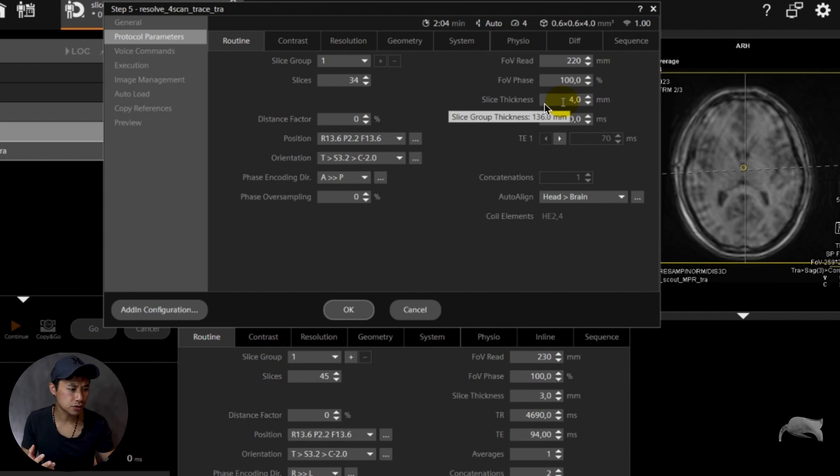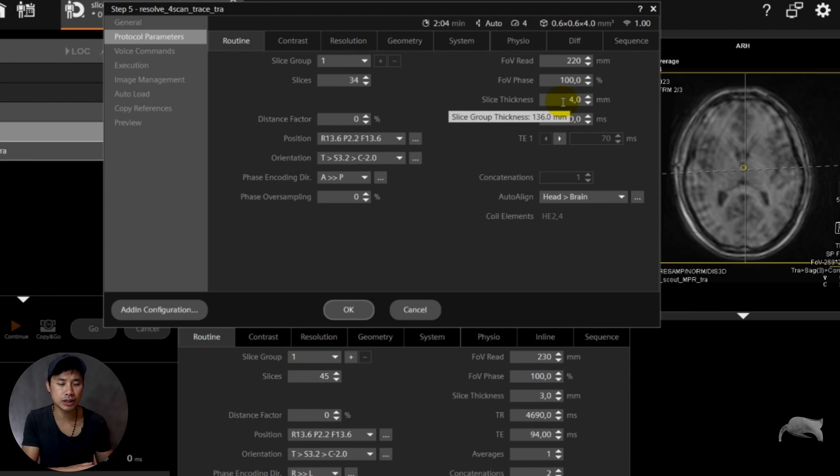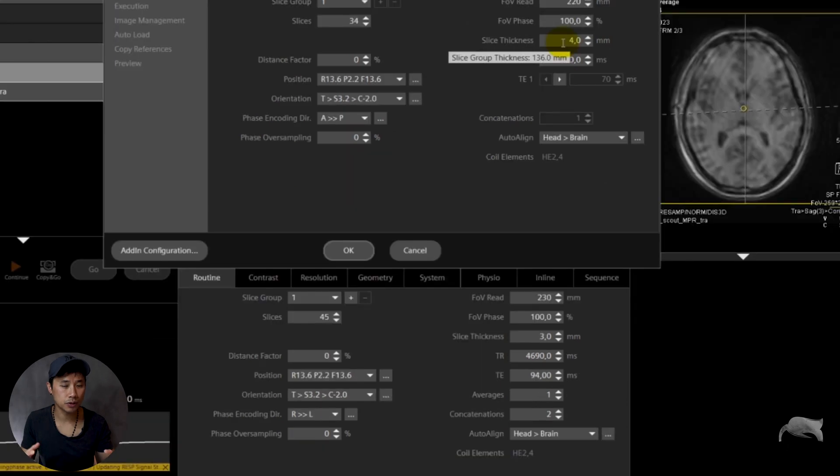Just hover the mouse over there and you can see — it's a very helpful tool, not only for a newer imaging but for every sequence and for the whole body. That's it, guys. I hope you find this video valuable. Even though it's a simple tool, I use it every day just to know that I have the same coverage from one sequence to another. Of course you'll try to have the same slice thickness between sequences, but sometimes that's not possible, so you'll try to at least keep the same coverage.